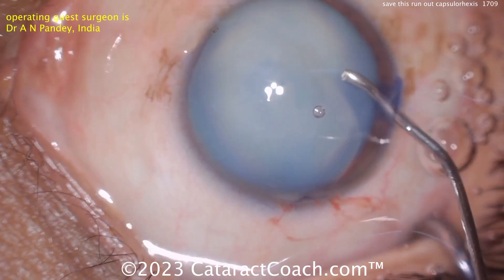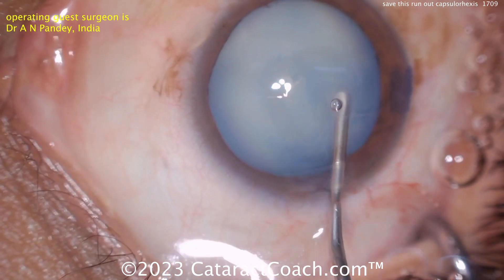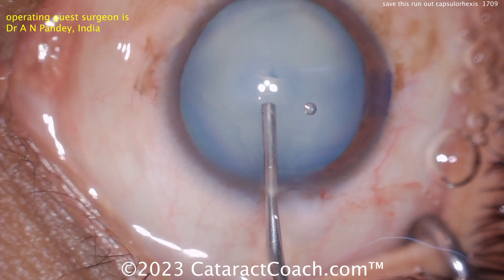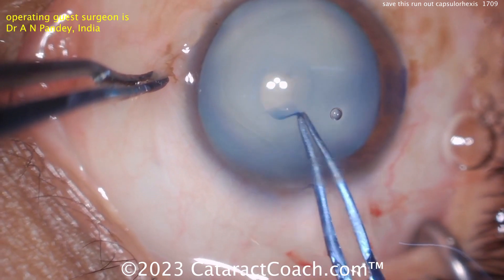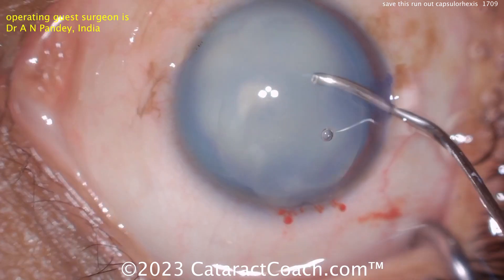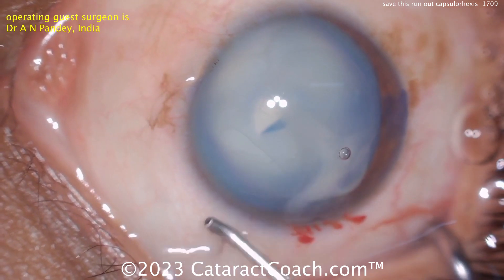There's a lot of fluid — milky lens material — coming out. We sometimes like to do an aspiration of it, but you can also just do a double rexis quickly and efficiently: make a small baby capsulorexis. It doesn't have to be perfect or regular.